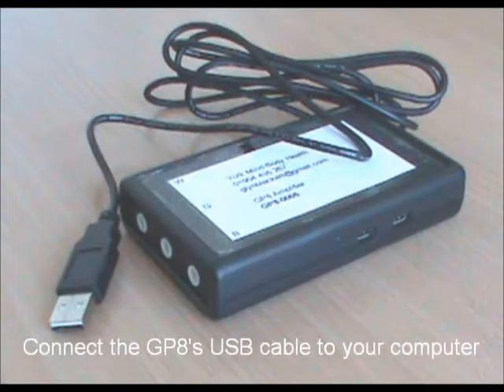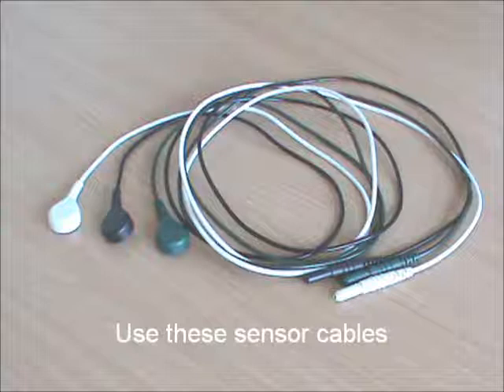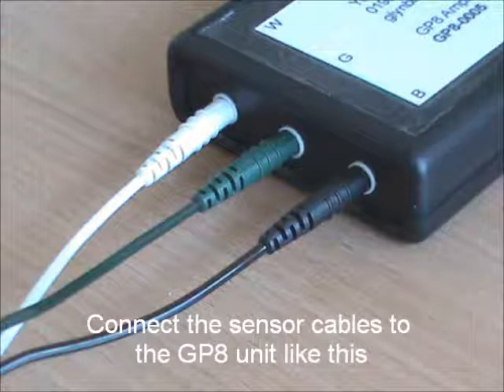Plug the GP8 amplifier into an available USB port on your computer. Use the set of 3 sensor cables shown here. Plug them into the 3 sockets at the front of the GP8 unit. The white cable should go in the left-hand socket, the green in the middle, and the black on the right.